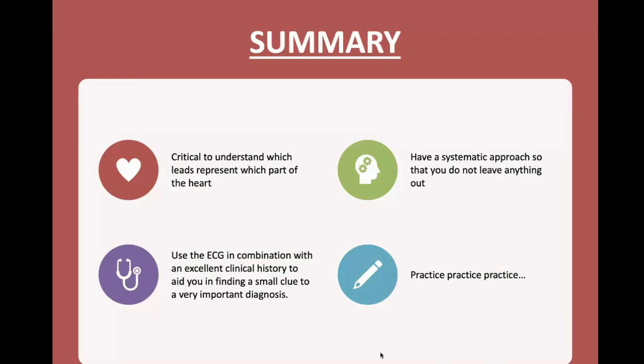So now for my take-home summary points. It's critical to understand which leads represent which part of the heart. Remember to use the ECG in combination with an excellent clinical history to aid you in finding a small clue to a very important diagnosis. Have a systematic approach so that you do not leave anything out. And practice, practice, practice. The more ECGs you do in patients in the ED, the more comfortable you will become with interpreting them.